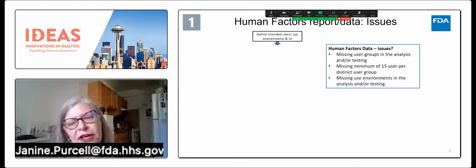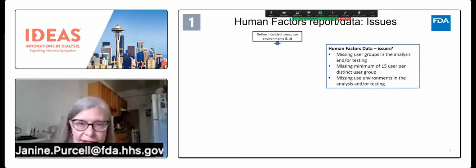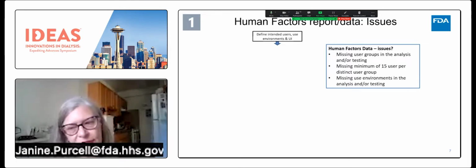As I perused a body of comments that have been delivered to industry, I noticed in one case that it's very important even to consider how you're simulating the fluids that are being used and are being interacted with during the simulated use. For example, the blood products should be simulated by a liquid that has the right viscosity and color as real blood, for instance, because detail like this could have an impact on what takes place in the validation testing and could skew your data results in a way that would not be helpful to your submission.